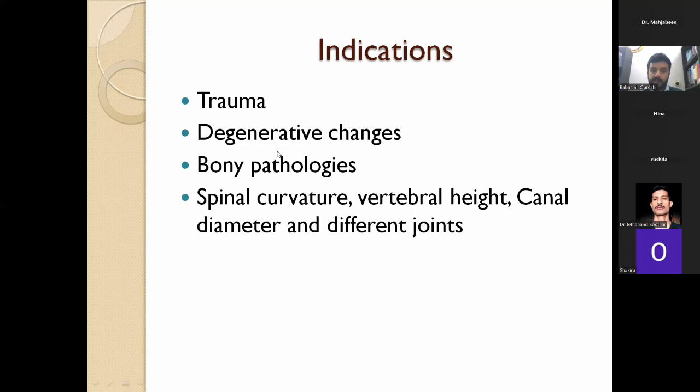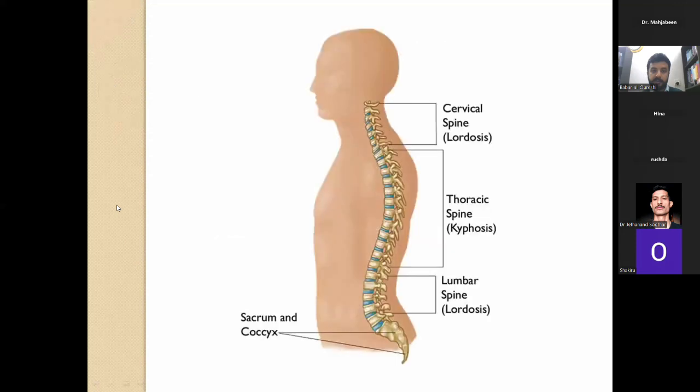To study the spine, MRI is the gold standard, which will tell us more about the spinal cord and theca, which can be appreciated on the MRI. CT scan is just going to tell us about the bony anatomy. So in elective cases, it has a limited role. MRI is the more suitable first investigation that we go for. Only when we want to pick up degenerative changes will we go for the CT spine as well.